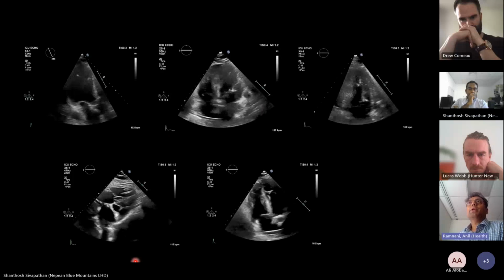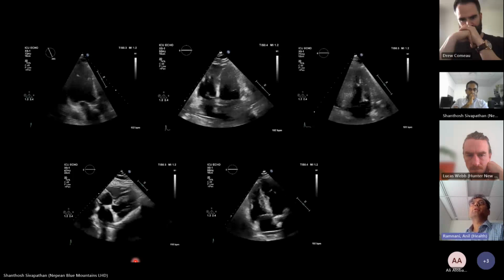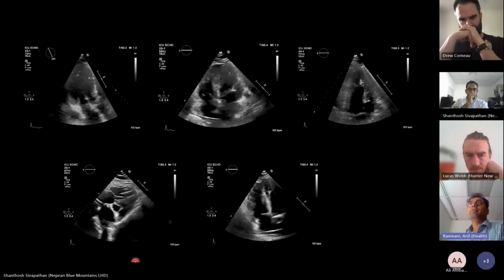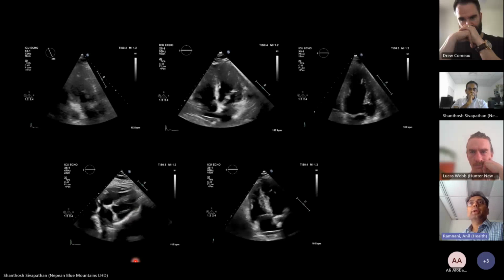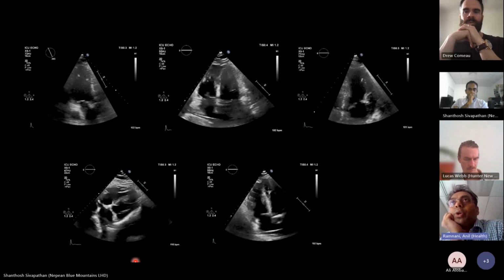Predominantly, one of the things that I can see is decent contractility, which is not in keeping with somebody recovering from an acute MI. Maybe inotropes, vasopressors, maybe bleeding from the angio site, and they are underfilled as a differential. I would like to see the IVC as well, and to see if they are well filled or not. Now, coming to the last image, I'm actually worried about the right heart.